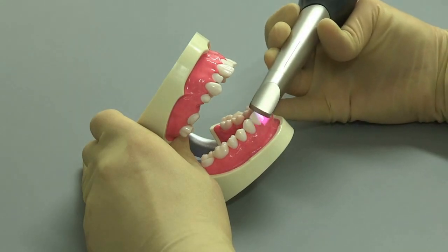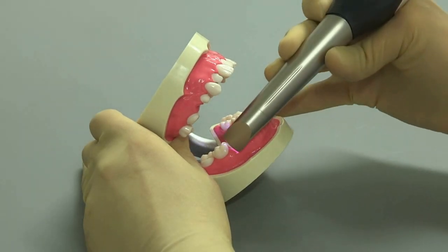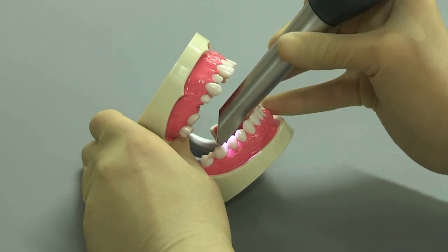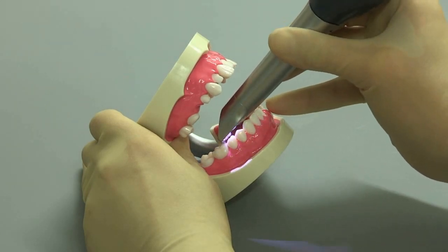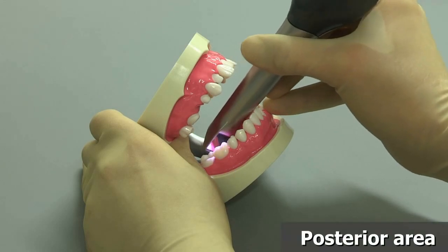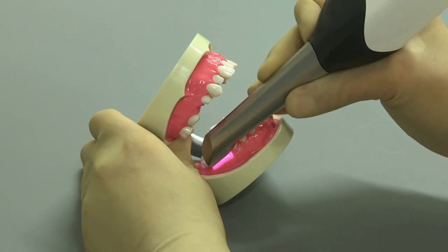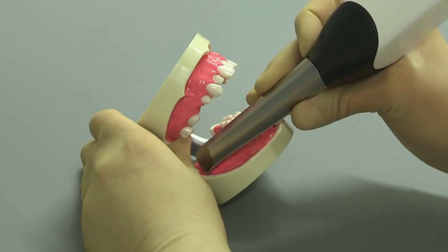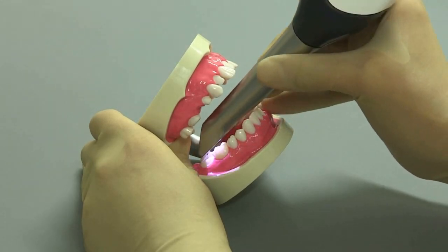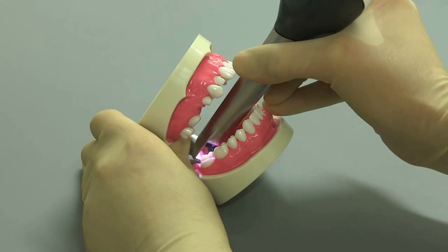Now guide the camera labially in the mesial direction and back again in order to complete the labial acquisition of the front teeth. For scanning the premolar and molar regions, now again guide the camera in occlusal, buccal and lingual view.